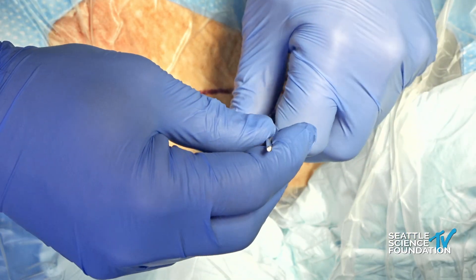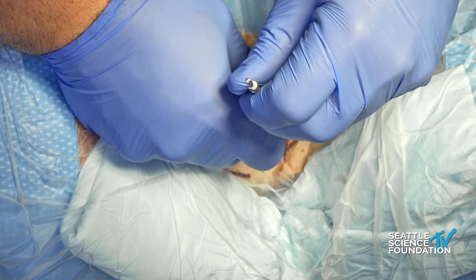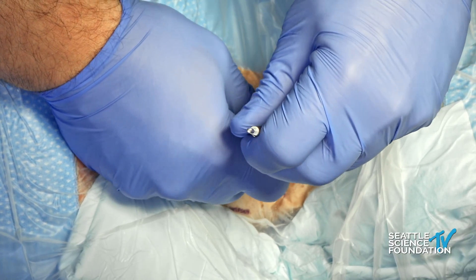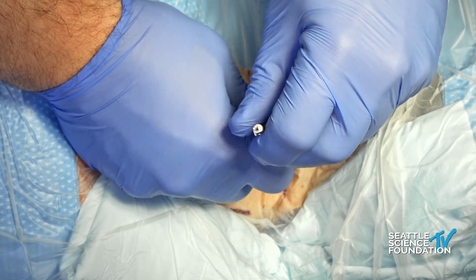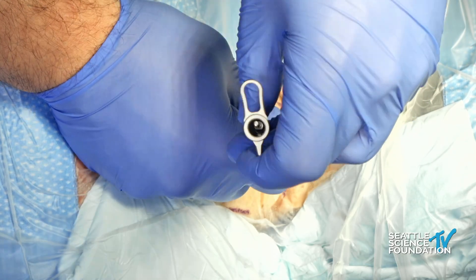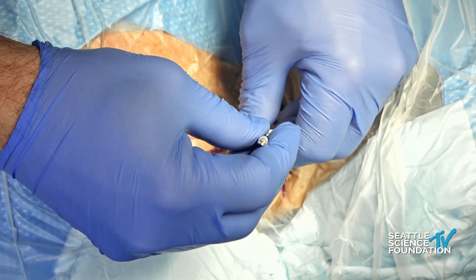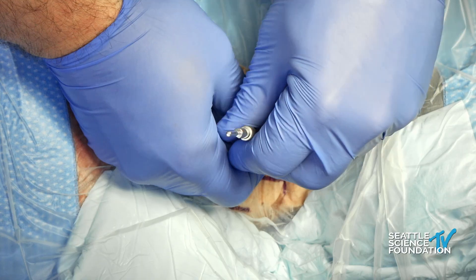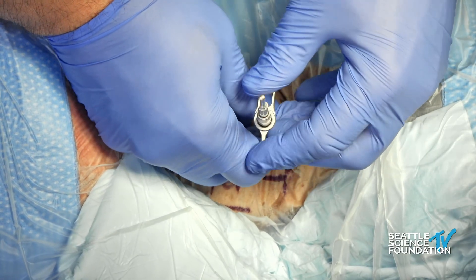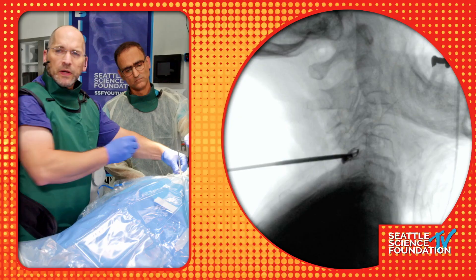Bevel facing laterally so we push the tissue to the side, with a little bit of tissue dissection down there, making the next step easier. Rotate them on the way in. Place the first tube — let's take an x-ray to see where we are.